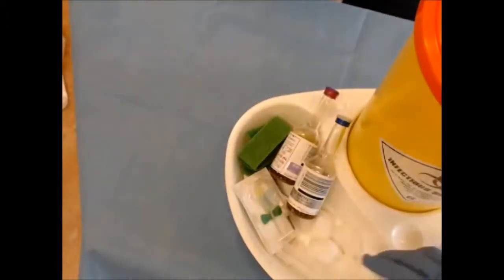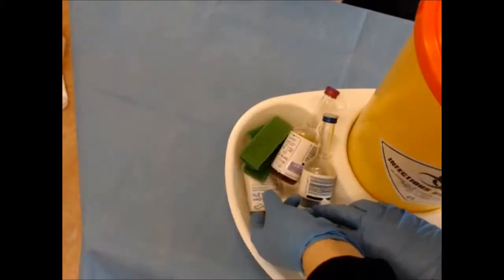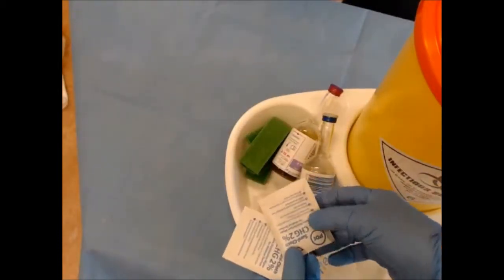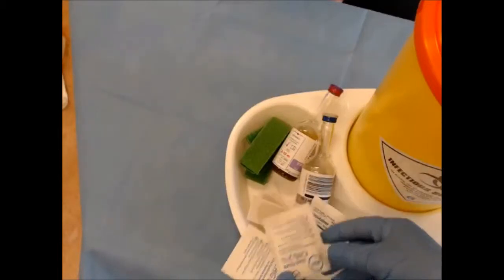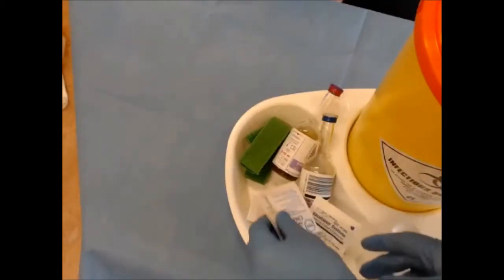You will need a disposable tourniquet. You will need something to clean both the patient and the blood collection bottles with. So we use alcohol with chlorhexidine called sani cloths.